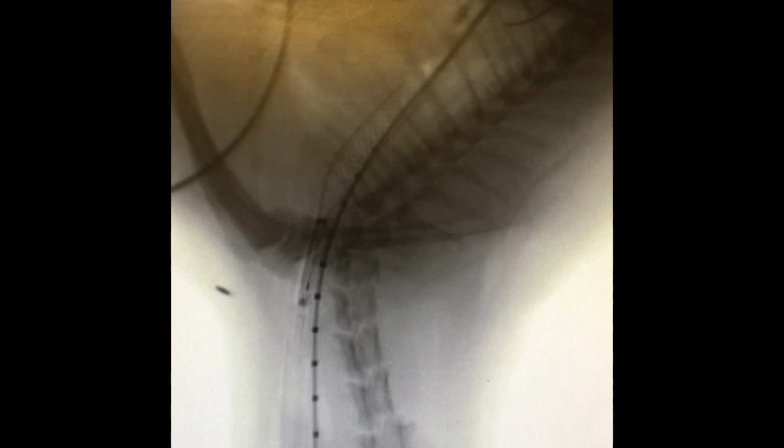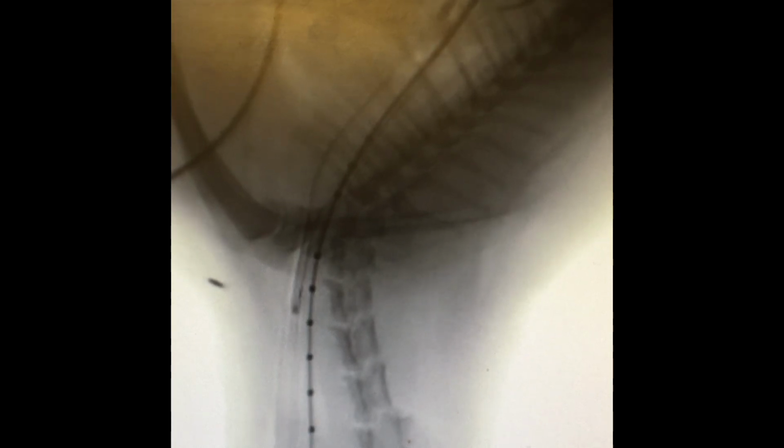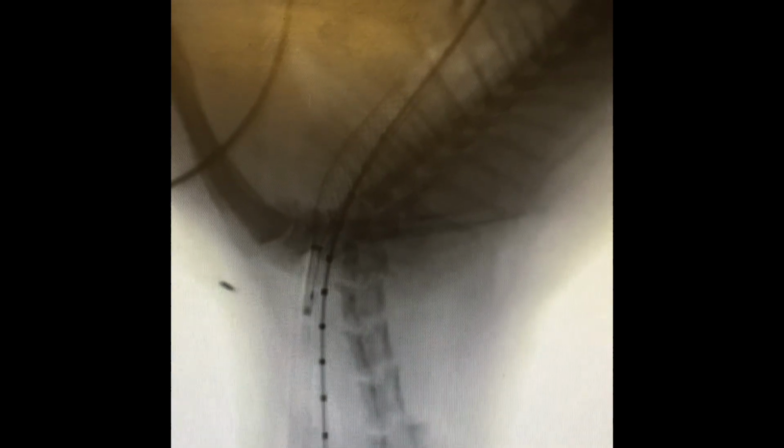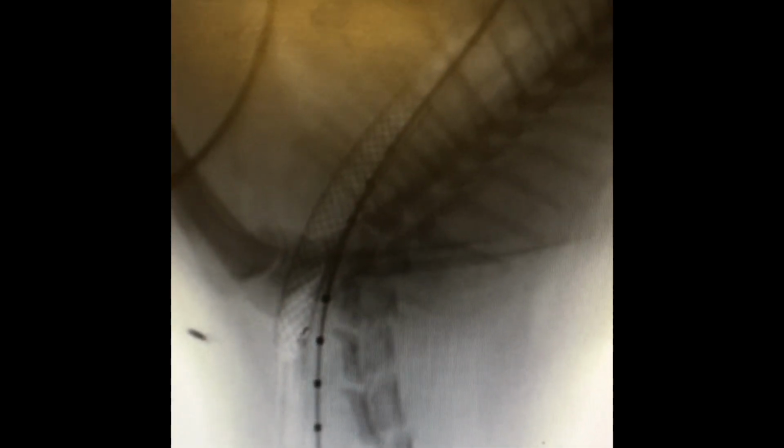Once the area of collapse is identified, a stent is measured and placed into the trachea using fluoroscopy, which is a video X-ray. The stent is made of a specialized material that is mesh, flexible, and is able to expand to hold the trachea open and allow the patient to breathe normally. The stent is initially held in place simply by its expansion into the trachea, but over several weeks, the tracheal tissue will grow through the mesh and hold the stent in place permanently.